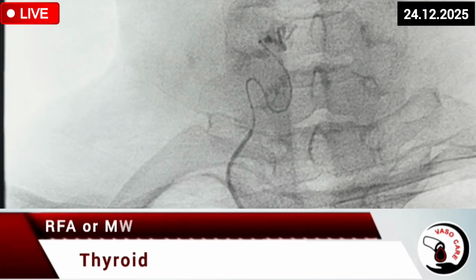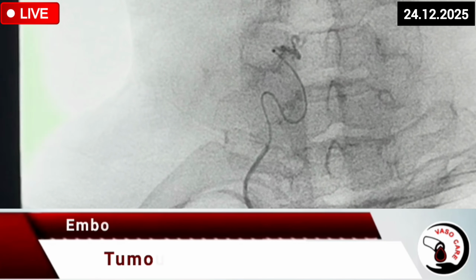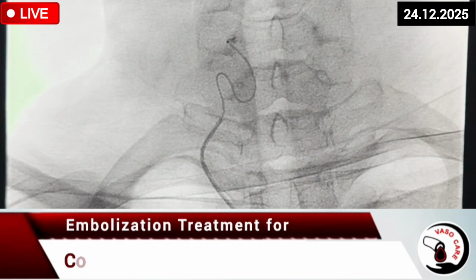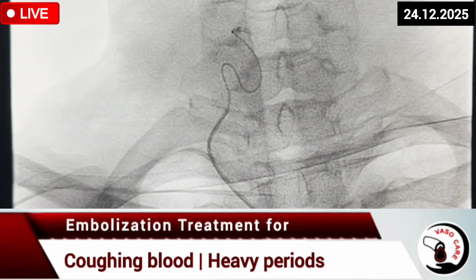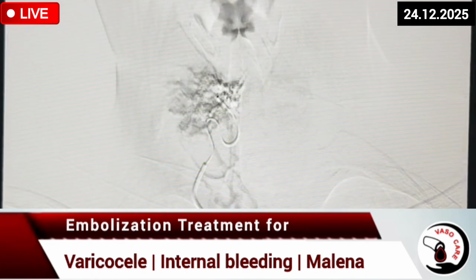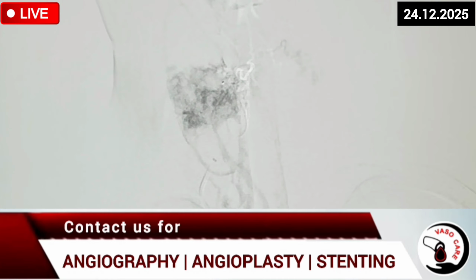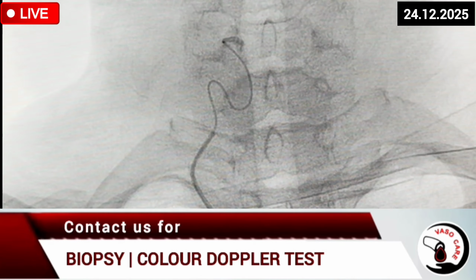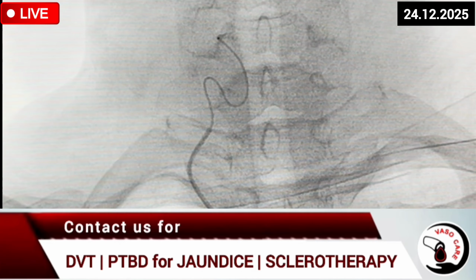Yeah, you can see slowly we are putting the particles. It is a type of medication of the particles by which we embolize the thyroid artery abnormal branches, so that the abnormal functioning thyroid gland is embolized and blood supply is blocked, and the thyroid level should come down.